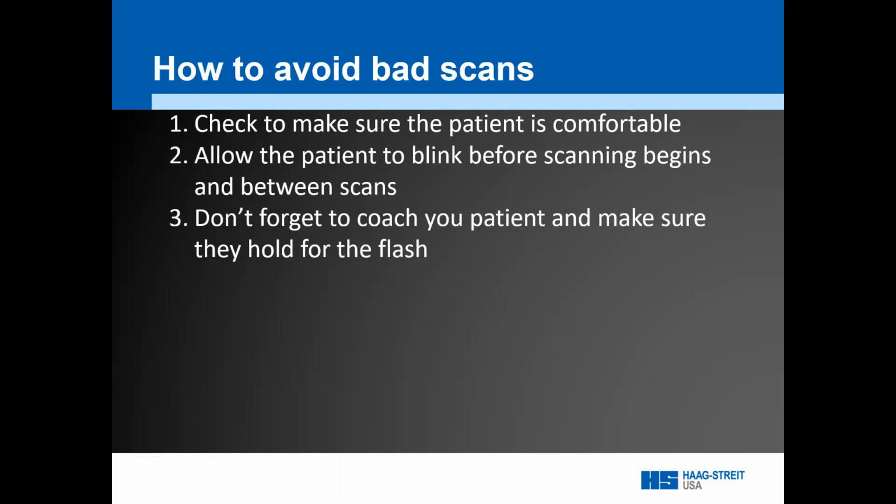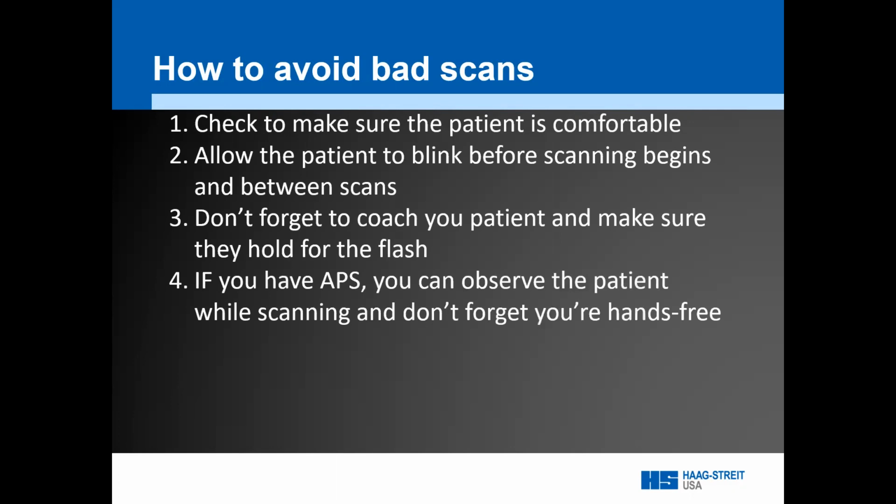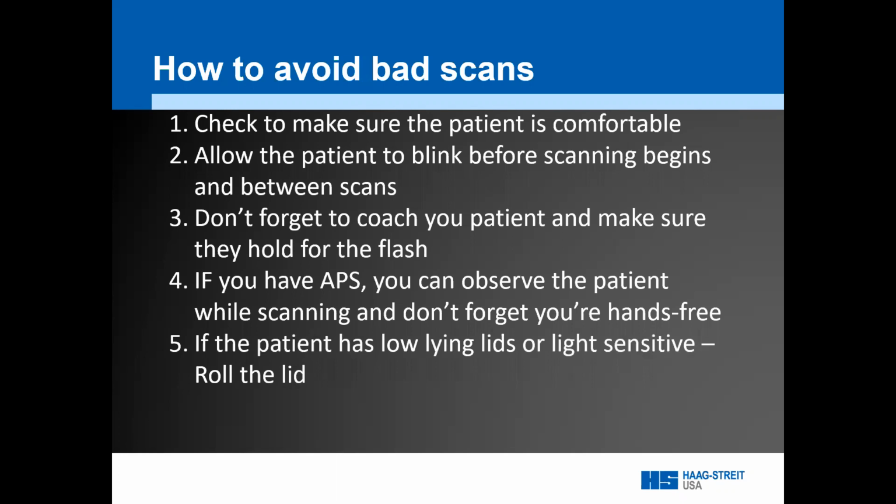Don't forget to talk to your patient, coach them through the process, so you make sure they're holding for the flash and blinking in between. If you have APS, don't forget you're hands free and you can sit to the side and monitor your patient and make sure that they're doing the right thing at the right time. It also allows you to roll a lid if you need to, if the patient's blinking during the flash of light.